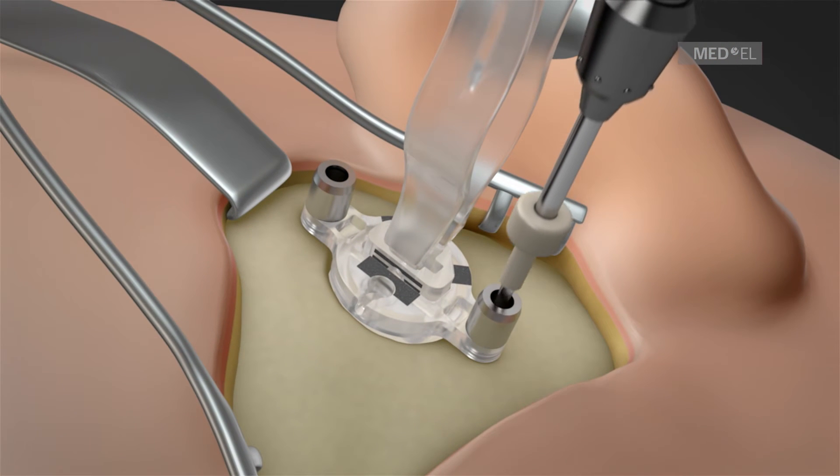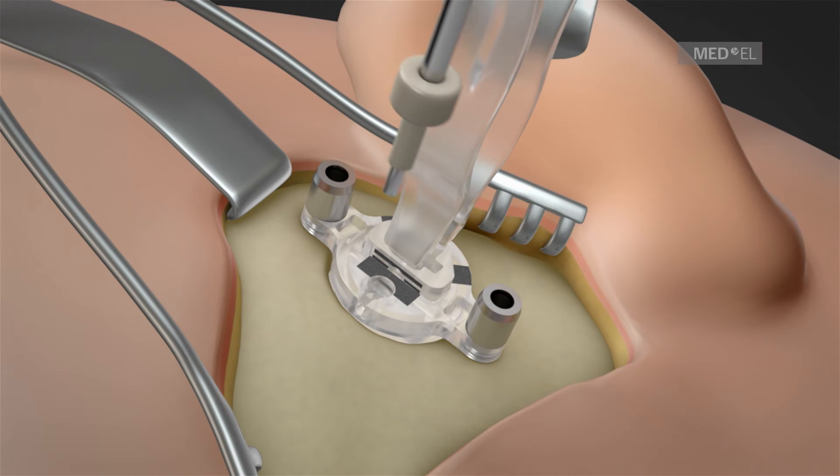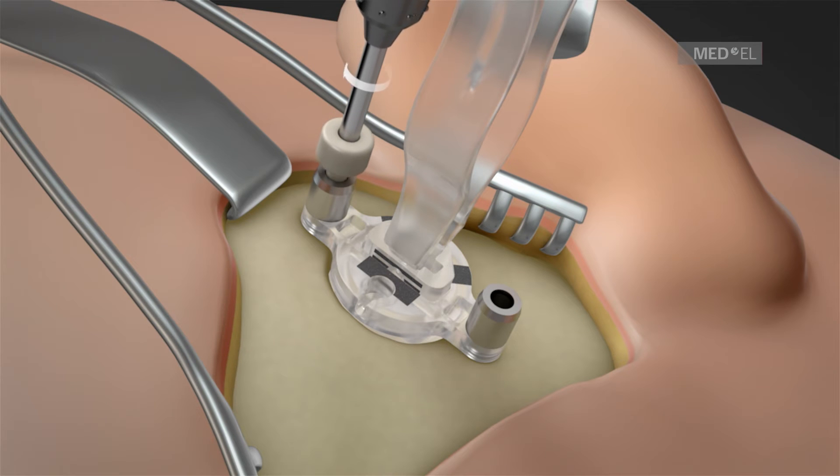Using the bone bridge drill bit, which is supplied in the BCI implant kit, the fixation holes are drilled through the flat transducer sizer.